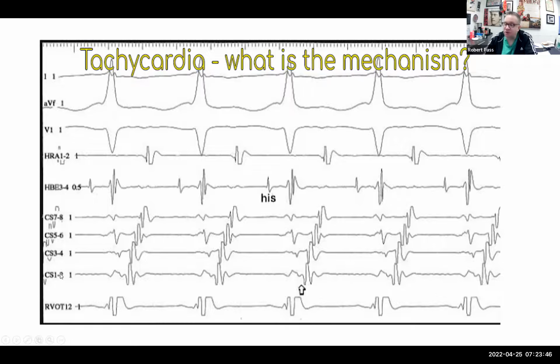Most people who can do both routinely will say that this is an area that is a little bit harder to reach retrograde than antegrade, and opposite pathways that are in the proximal area on the left side are a little easier, they say, going retrograde than going transeptal and then turning the catheter around a very large angle to get back to the area of the pathway.